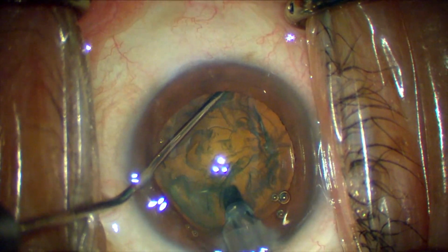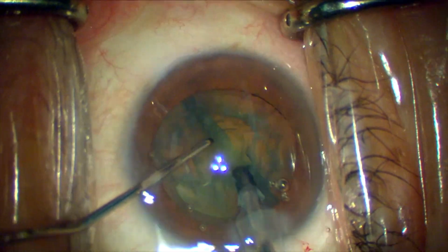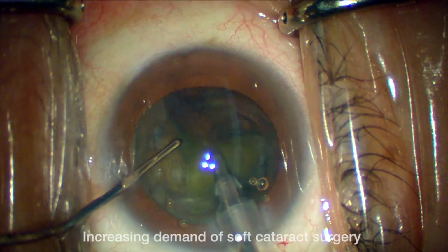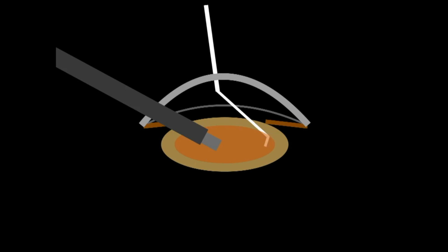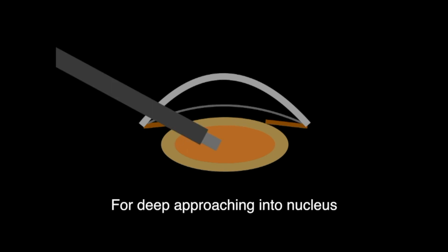In this video, I will introduce a newly designed chopper for approaching into the deep nucleus. There are demands of soft nucleus cataract surgery these days because surgery indications are much wider than before with the development of technology. It is difficult to approach into the deep nucleus with the traditional choppers because those were designed for use in the anterior chamber or in the anterior half of the nucleus.